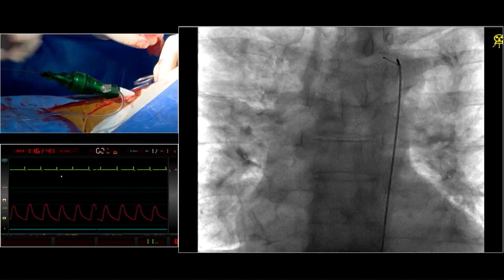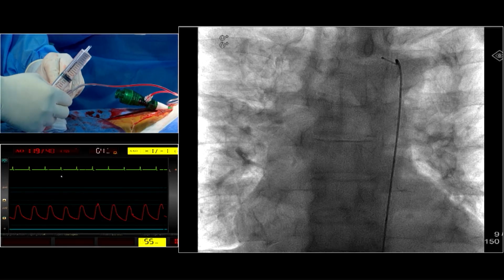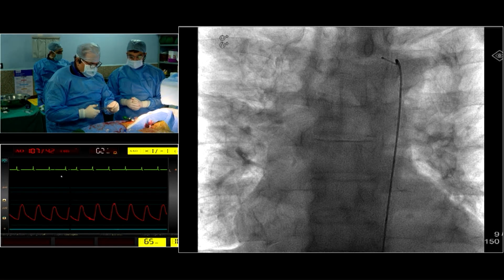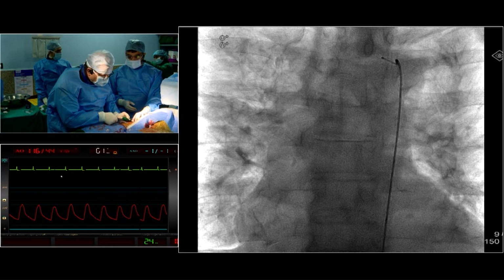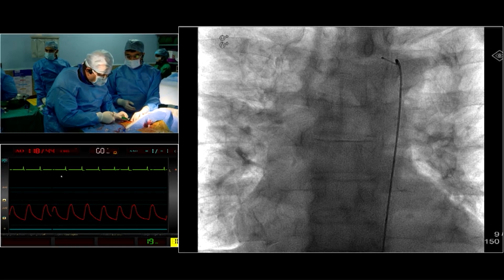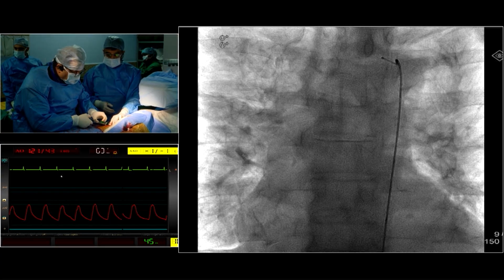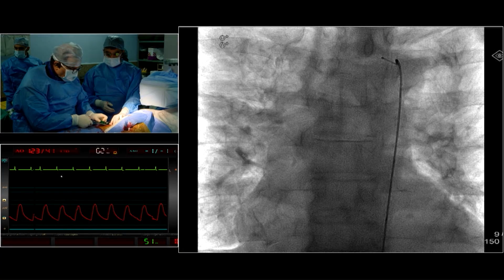Let's give full dose heparin now. So at least let's give 9,000. 2,000 plus 7,000. So there are 2 ports to suture. You can see there is one port on the left hand side, the other on the right hand side. We make sure that you take a bite enough proximally to the port so that even if the sheath moves, it moves in rather than coming out during the exchanges of the balloon and the THV.